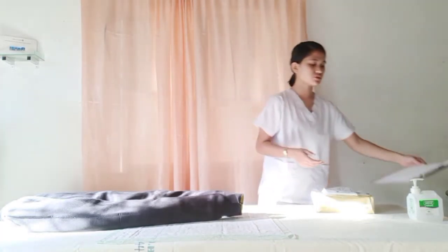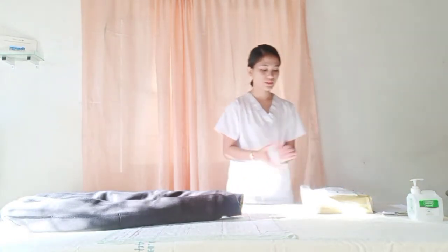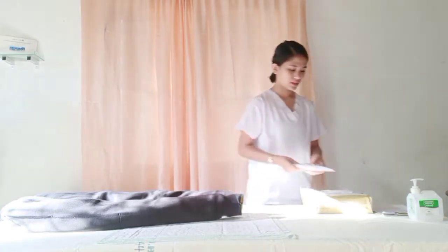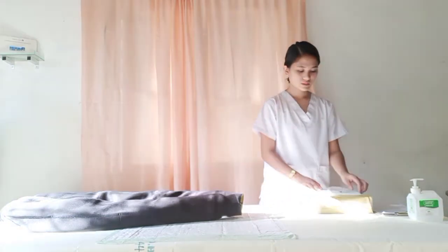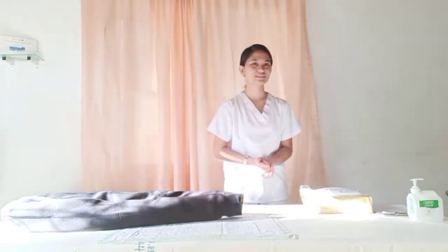Okay, so now that everything is all set, I'm going to show you the equipment that I will be using. Gather the equipment. The equipment that I will be using is, of course, our urine bag and our urethral catheter kit. Okay, so I think I am good to go. I can now go to my patient.